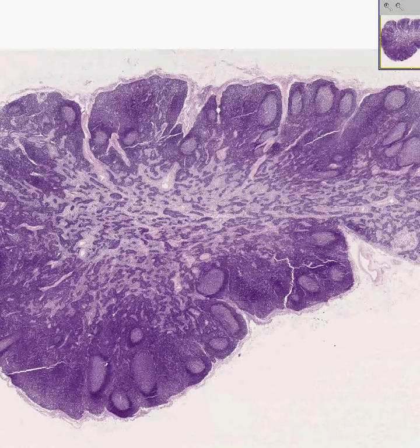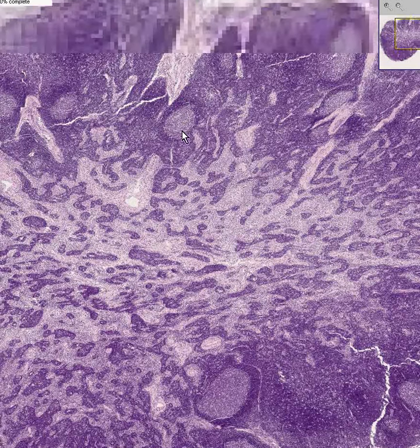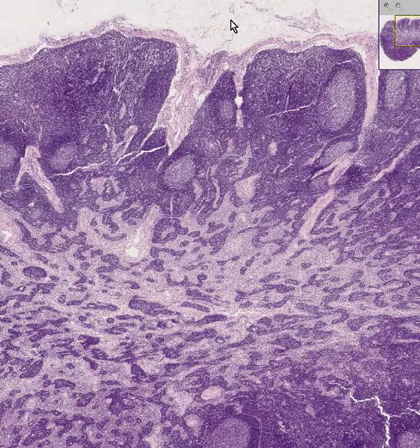Here is some more lymphoid tissue. In fact, it looks like it's differentiated enough to be an actual lymphoid organ. And in fact, it is the most classical picture you will ever see for a regular old lymph node. This is a classic appearance for a lymph node, any lymph node, and I'm going to tell you why.